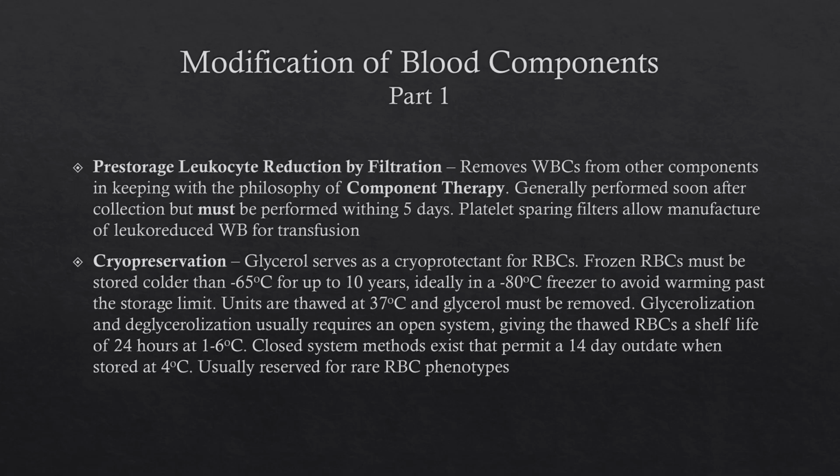In those cases, you actually get a 14-day out date when you store it refrigerated. That's a distinct advantage with shipping and trying to get a rare RBC to a patient in the allotted time.